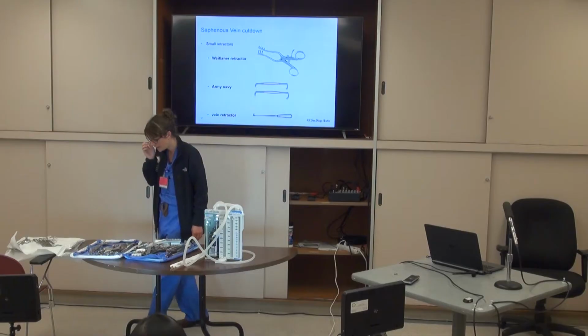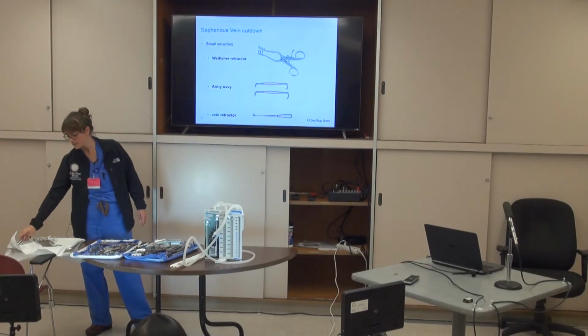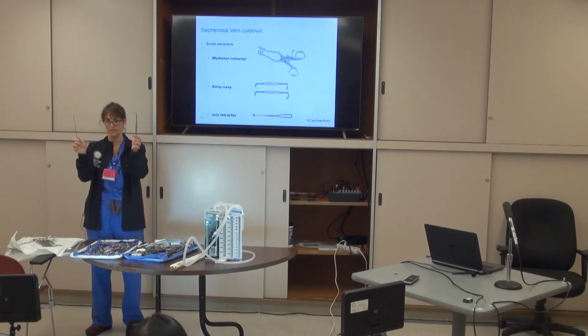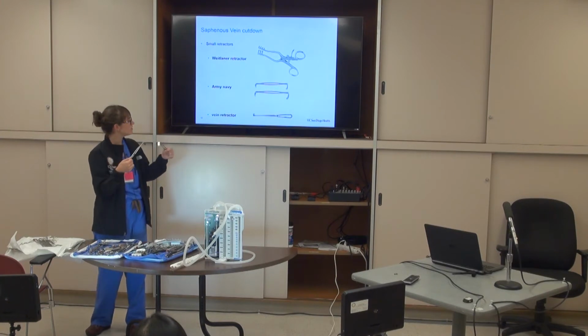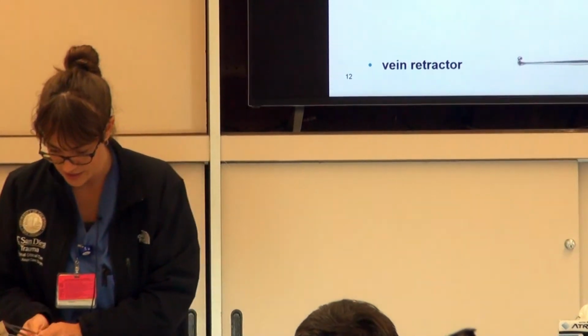Army Navy, that is actually in your bedside recess tray. Really useful, a little wide, so if they didn't make a big cut, they'll complain about it, but they can use it. It will work.